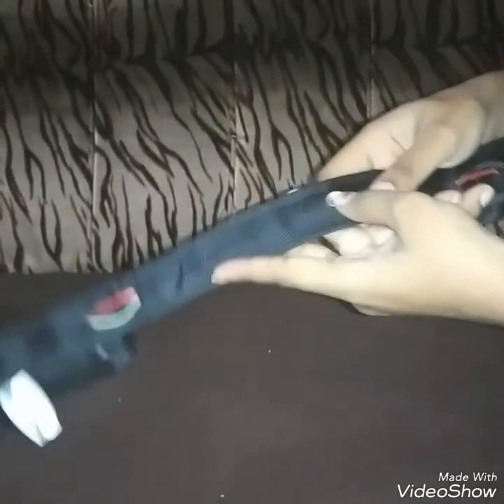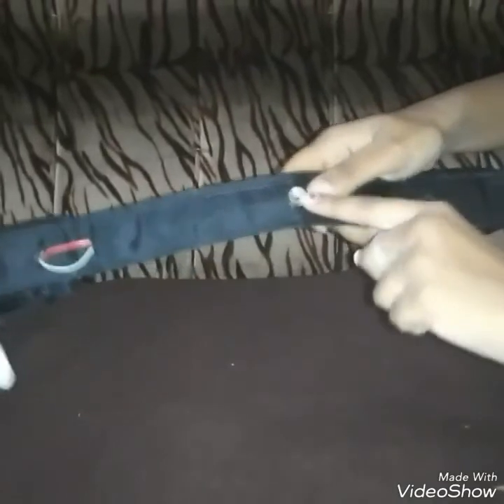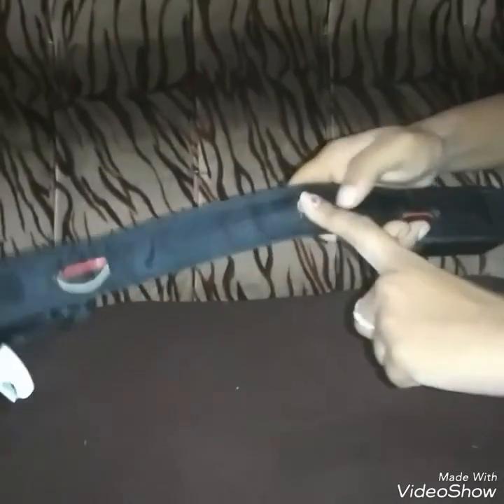This is a node which monitors the electrical activity of the brain, and this sensor makes the connectivity with the system with the help of Bluetooth.